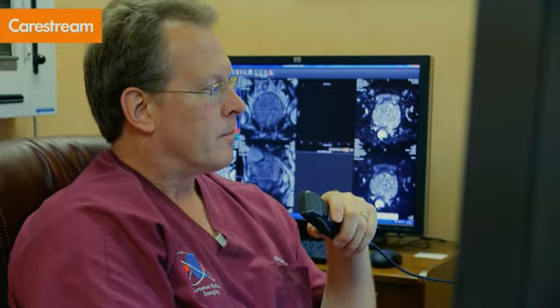What I've done by going with native dictation and the teleradiology platform is I've separated us from the RIS. We no longer care which RIS is being utilized, so they can pursue their own meaningful use for their referring doctors. Before, we used to depend on the RIS. The RIS was the one that was distributing the reports. It was distributing, also connecting to images. Now we bypass the RIS, and even if anybody from different offices would like to communicate with their RIS, we can do that. That's not a problem. We send a message to their RIS, but we give them an option totally independent. They don't have to depend on the RIS anymore.